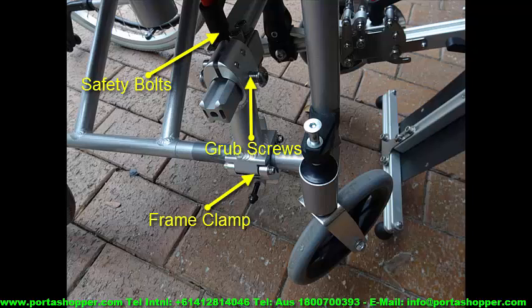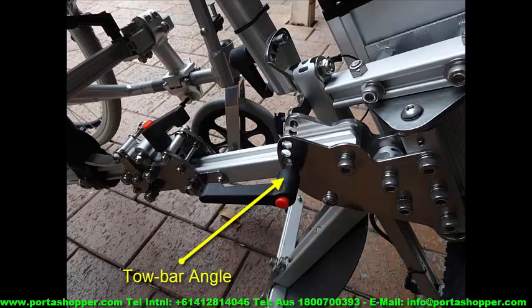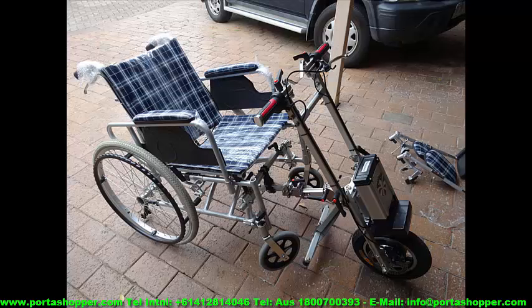Furthermore, make sure all these bolts and clamps are tightened properly for safety's sake, as well as to ensure that you don't have too much flex on the tow bar. Also make sure that the tow bar points downwards enough so you can achieve enough clearance on your wheelchair front casters. The Portawheel stand can also be adjusted to make sure your tow bar and tow hook line up perfectly.